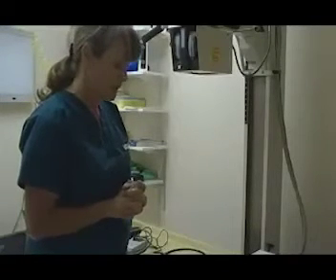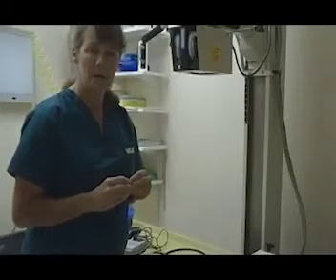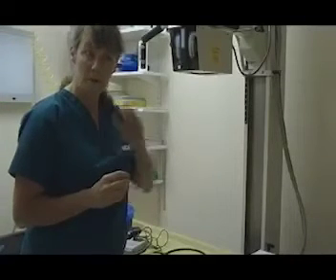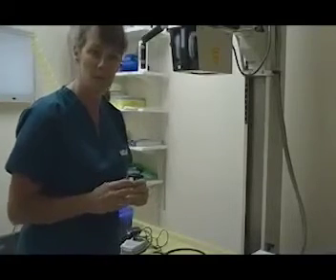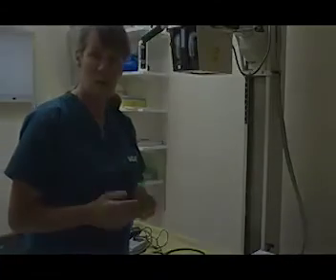anesthesia monitoring. I think I've covered just about everything here. Again, it is critical to monitor these vital signs every 5 minutes in P1 and P2 patients, and consistently for P3 through 5 in patients that have been under anesthesia for 45 or more minutes. So that covers anesthesia monitoring and the use of an anesthesia chart.